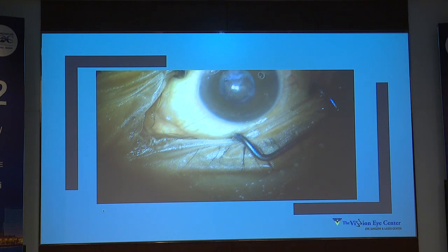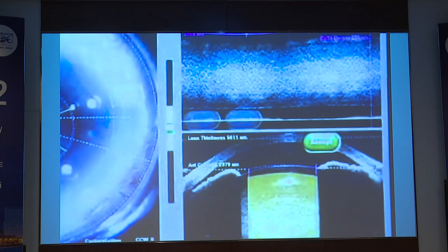How can we tackle smaller eyes with smaller anterior chamber, small axial length? Look at this case. Here I have, as I told you, if you can see very clearly, bad cornea, big arcus, huge cataract, small pupil, patient with prostate medications, so the iris is not going to be good with you, one-eyed. Tell me, what more trouble do you want in life? From a surgeon standpoint, look at the anterior chamber at the angle, it's closed. Look at the size of the anterior chamber. So, well, that's how it is.